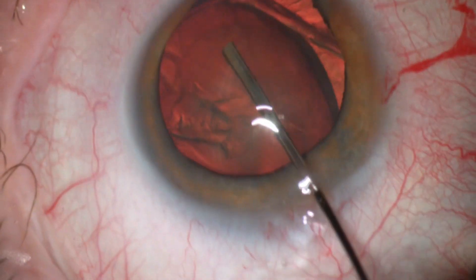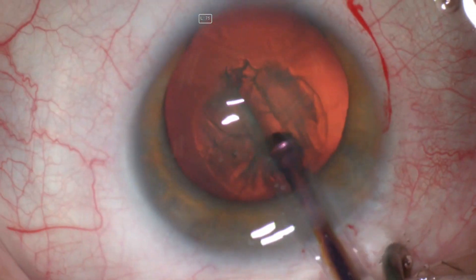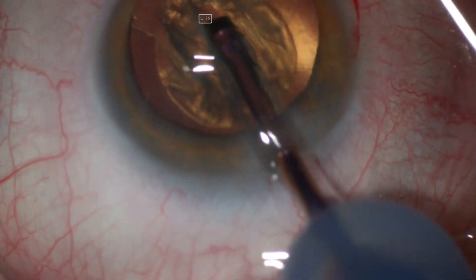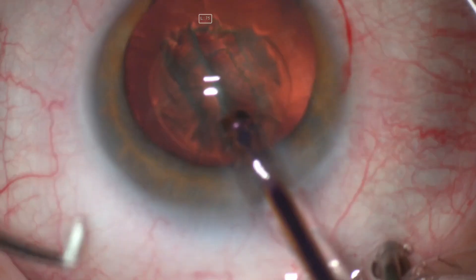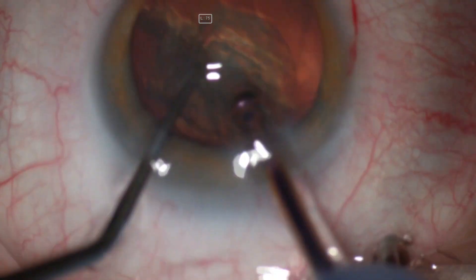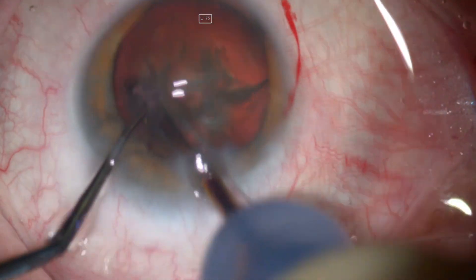Capsulorhexis was made about five millimeters in size, centered around the Purkinje image. Hydrodissection was then performed in the usual manner and the lens was rotated a couple of times. This patient has about plus two lens.